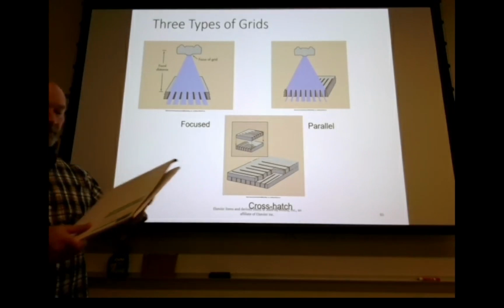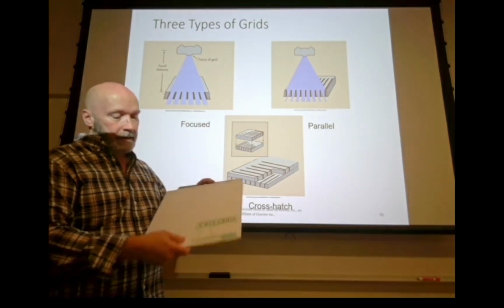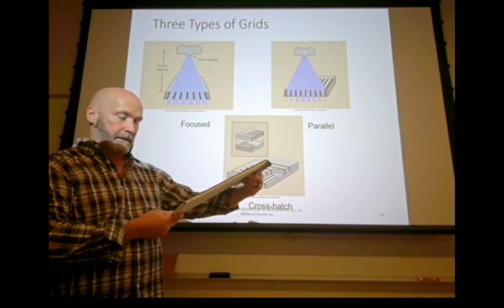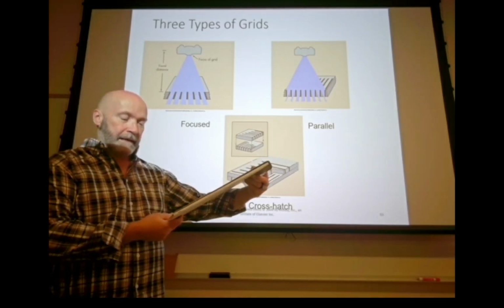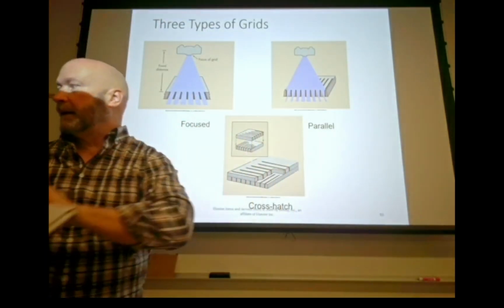Okay, so this is what we refer to as a tape-on grid, and I'm going to pass it around in a box, and it's 11 by 13, which is a real strange size. It's an 8-to-1 grid, and it's parallel. So putting that up there like that.